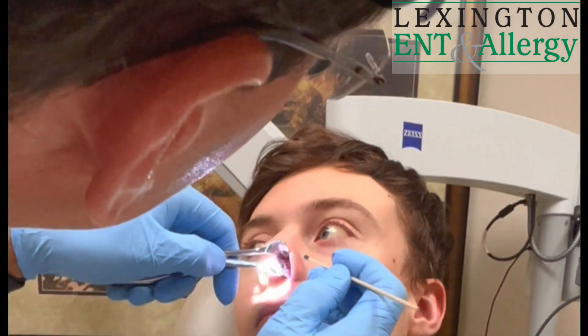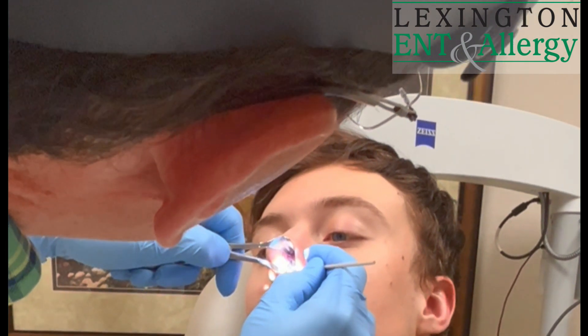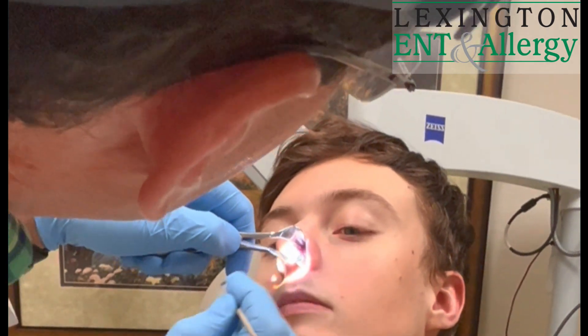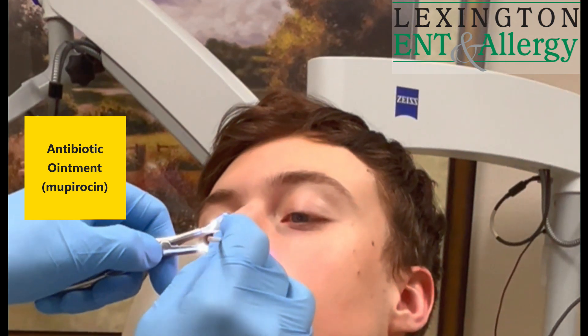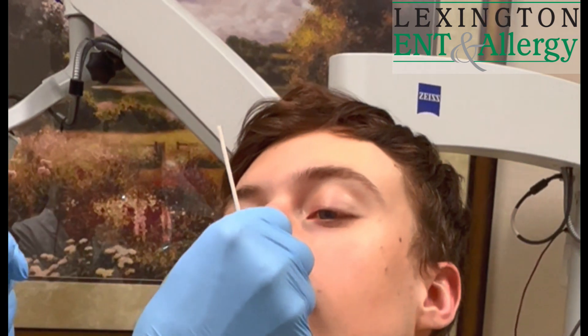Still need to do a little bit more. I'm going to put a little ointment in there. Just take a little glob of ointment and I'm just going to smear this really just up the crease of the nose and pinch that to rub it around a little bit.